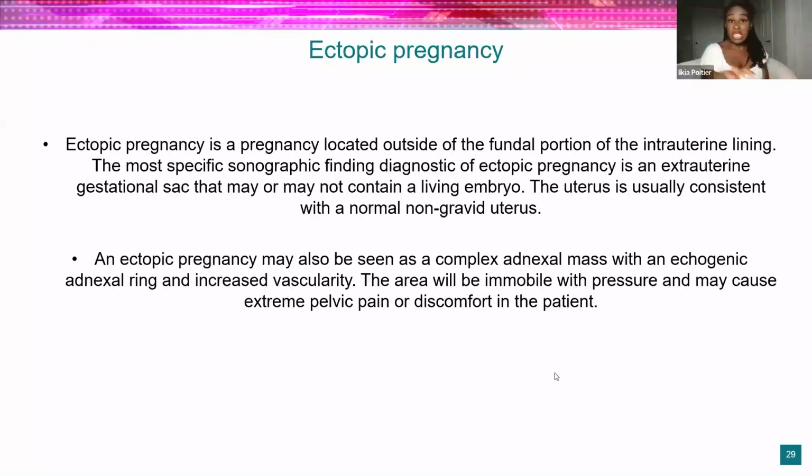If we don't see that gestational sac, automatically we're surveying, right? So I survey, and then we make sure we don't see any ectopic. The ectopic will appear as a mass. It will have that anechoic area and that echogenic ring most times. And what's really important to use for this is color.